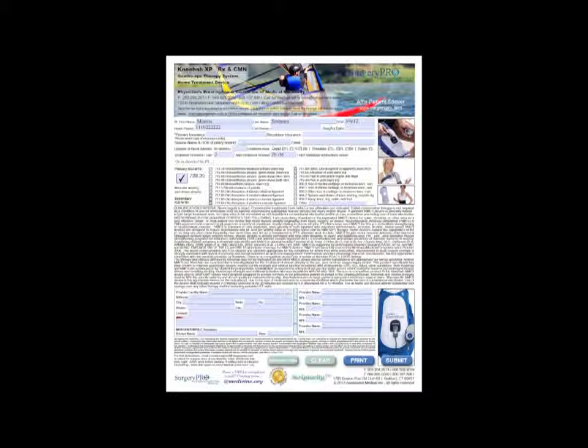This primary ICD-9 is required. You may have a secondary as well, perhaps. And again, I can just select, or I can put in my own. This is the CMN block, which describes the medical efficacy and rules therein.